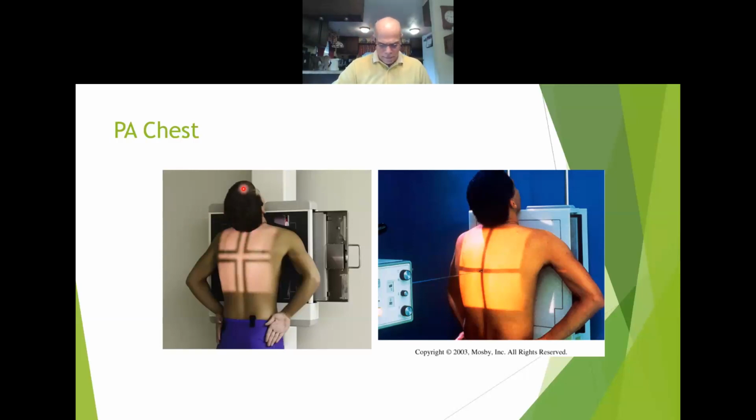Okay, but it does say have the patient's chin upward and over the top of the grid device, and adjust the head so the mid-sagittal plane is vertical. Ask the patient to flex the elbows. We have the elbows flexed and the back of the hands low on the hip. This is done for a reason.